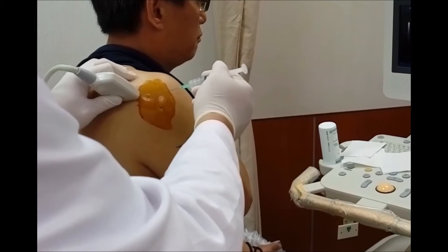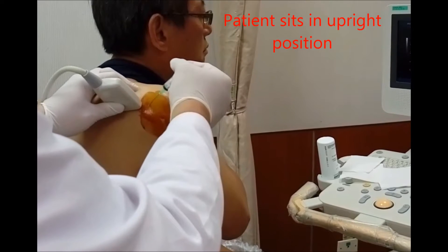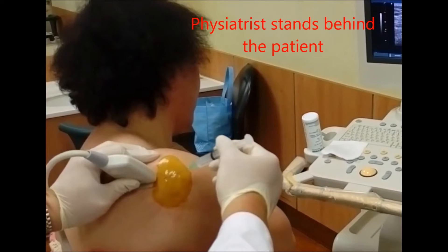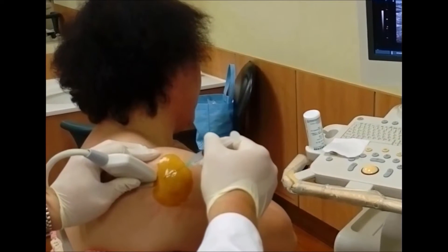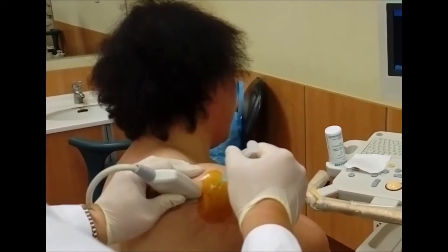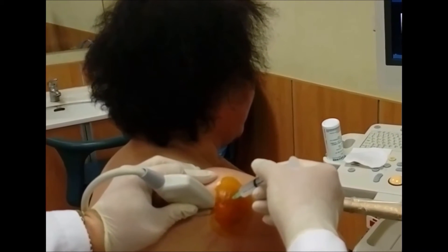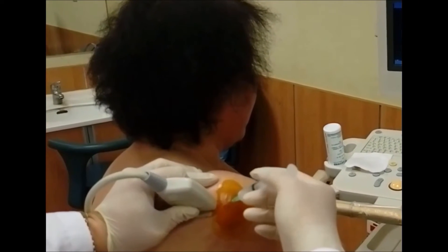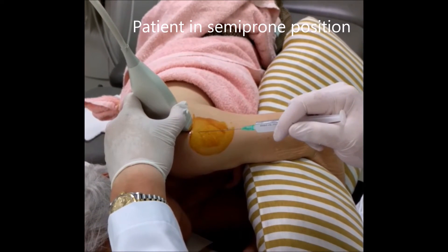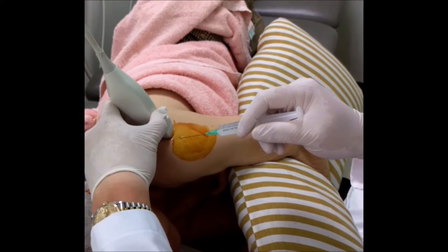The patient can be placed in a prone position or the patient can sit in an upright position, with the physiatrist performing the injection standing behind the patient. The injection site must be adequately disinfected. Ultrasound gel and gloves must be worn to reduce the risk of contamination and infection. This video shows the injection done with the patient placed in a semi-prone position. The ipsilateral arm can be placed over a pillow to optimize comfort and to maintain the semi-prone position.